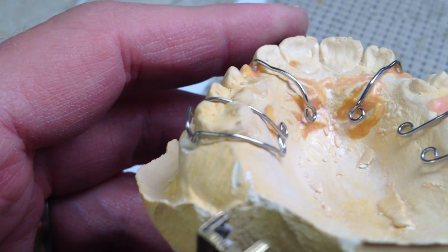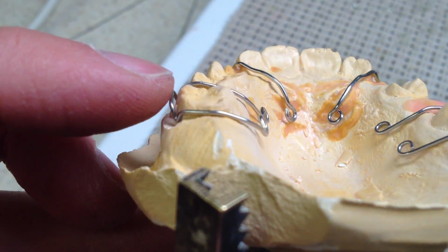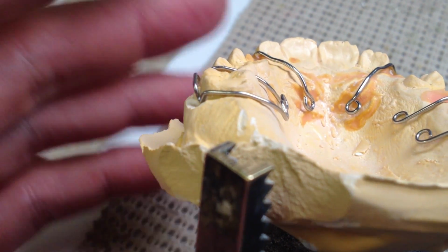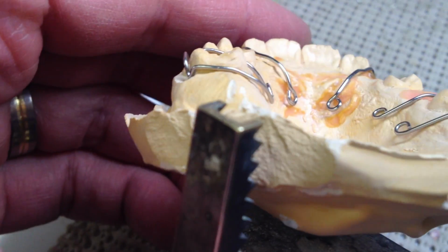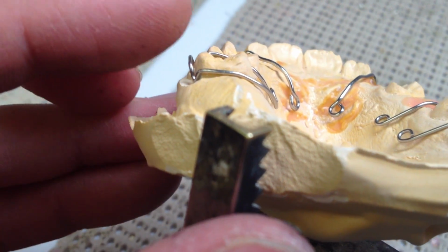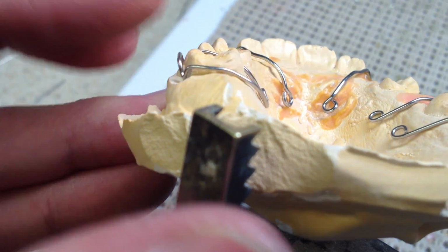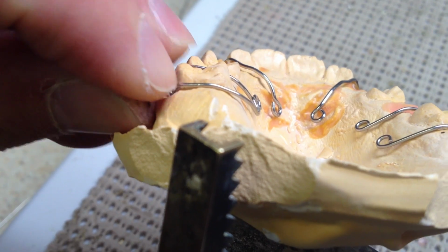Now put the other one on here, and you can kind of see the difference. This bridge is closer to the tooth, more parallel to the tooth than perpendicular, and that's about where I want it. So if I put my finger on it, if you move your Adam's clasp, you can see that you'll need to bend this angle.